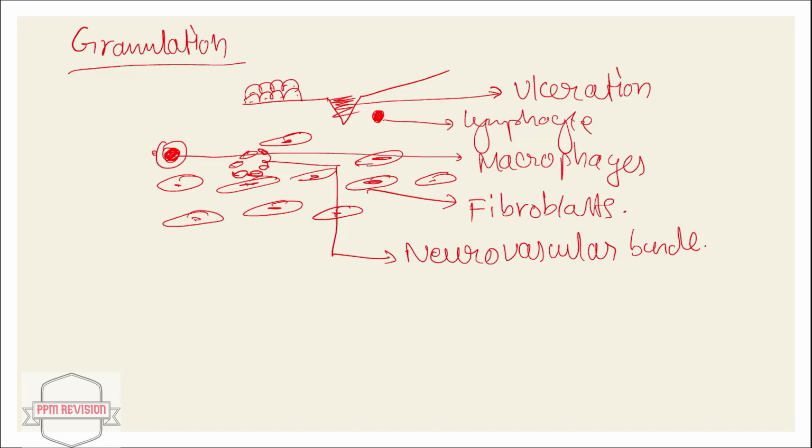The outermost layer contains a fibrin network with polymorphonuclear leukocytes also, and RBCs also. Deep to this zone, the capillaries are lined by a single layer of endothelial cells. Loosely arranged between the capillaries are fusiform fibroblasts with abundant cytoplasm and nuclei which are central and elongated. So as mentioned here, the fibroblast is elongated and has a central nucleus, and the cytoplasm is abundant in this.